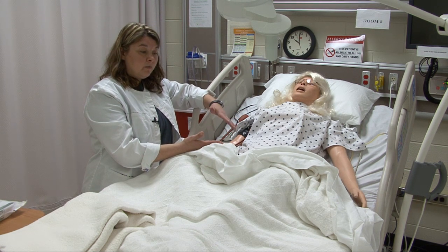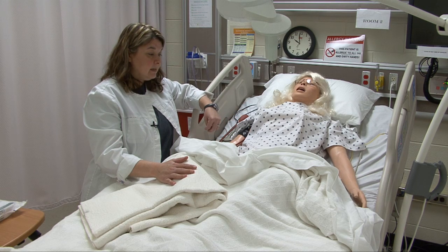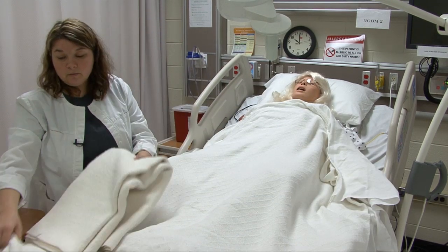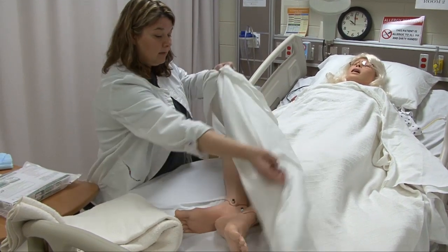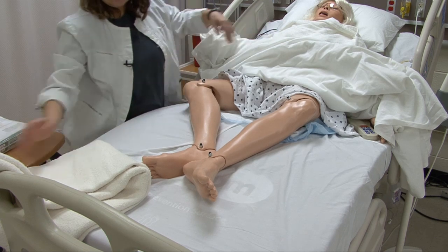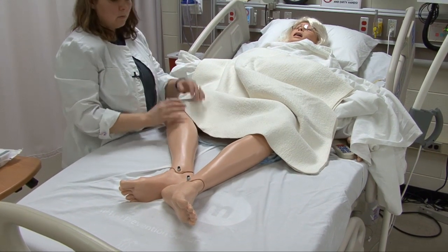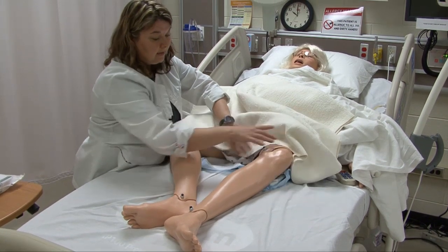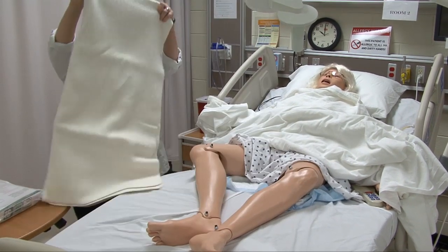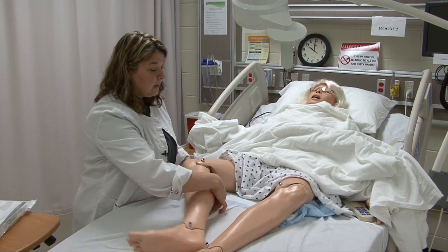The next thing is to provide for privacy for your patient. You've got a bath blanket to drape the patient's legs. Pull the bed covers up from the bottom part of the bed and uncover their legs while keeping the gown down to provide privacy, with covers up here on their chest. You could take the bath blanket and wrap it around your patient's legs for warmth and privacy. For the sake of this video, I'm going to move the bath blanket so you can see.